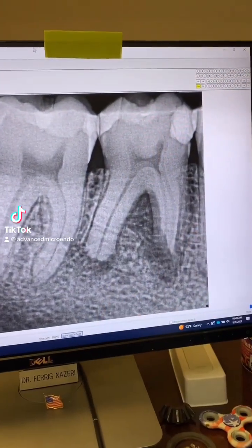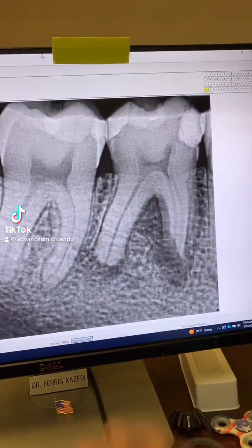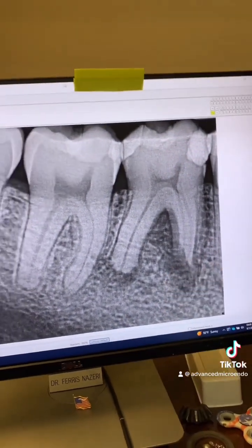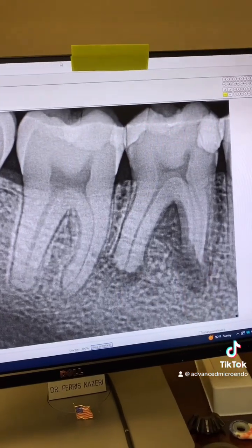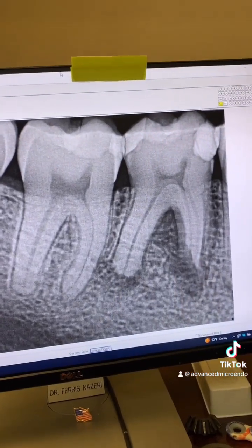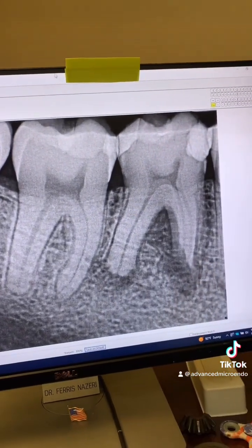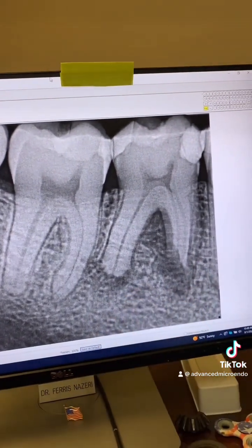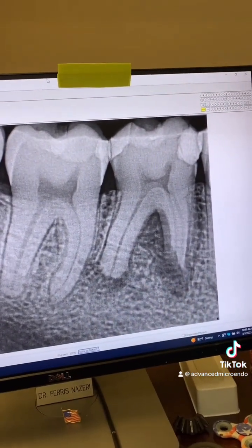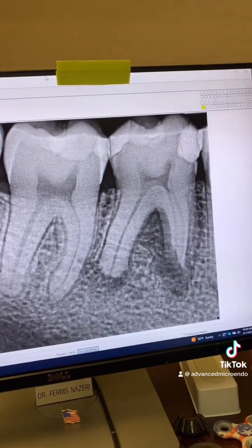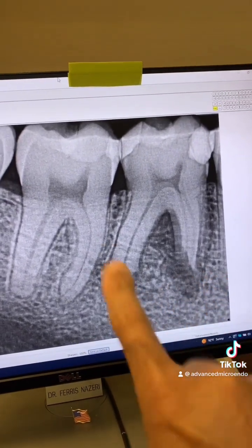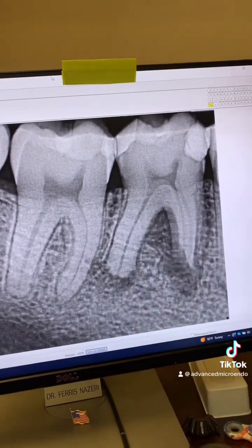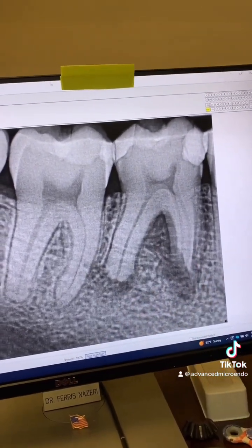Check this out. This patient was referred to me for endodontic treatment of tooth number 30. He was a wrestler — he's 18 years old now — and he said when he was younger he used to wrestle. I'm guessing trauma caused this.